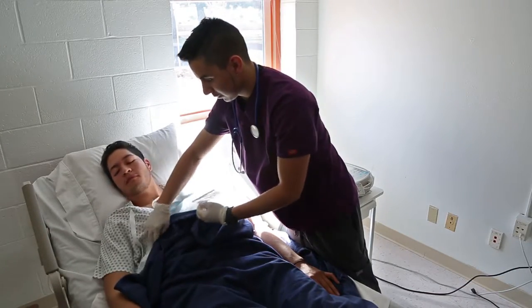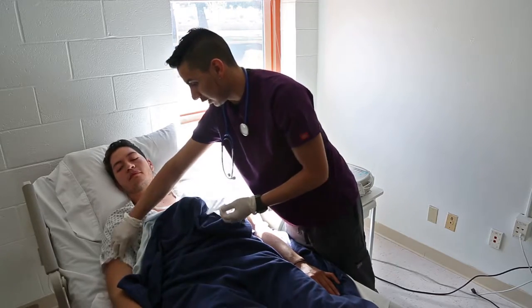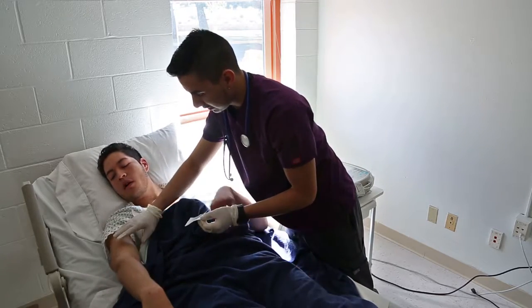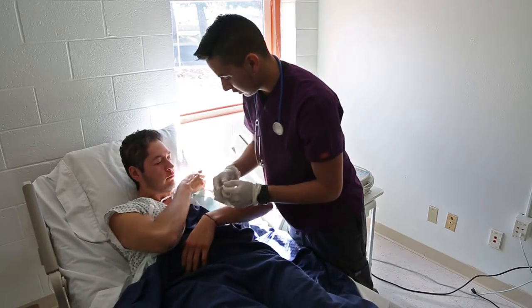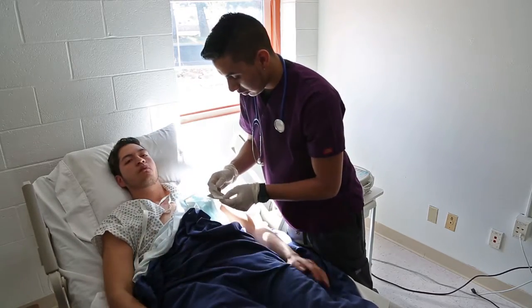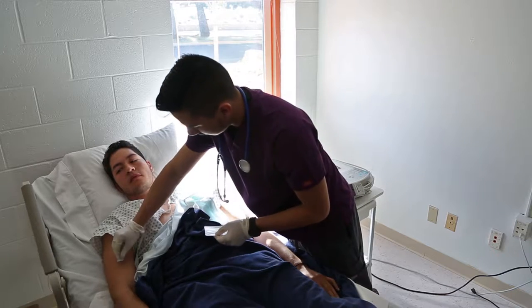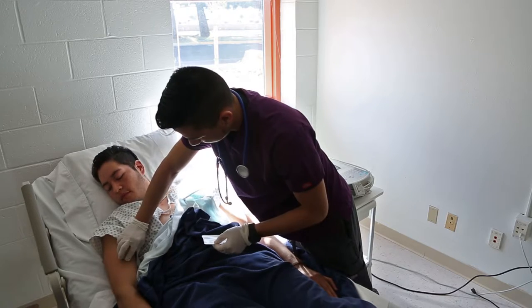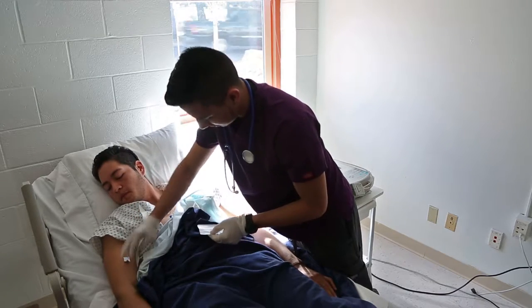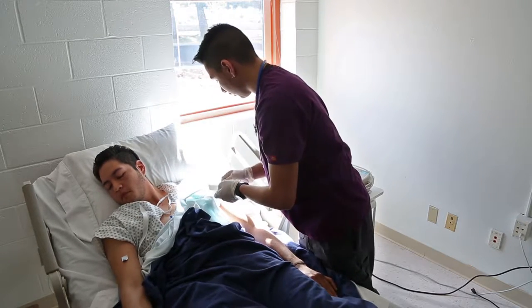I'm going to be rolling up your sleeve. You're going to place the electrode on the same level on both arms. Make sure you don't place it on any burns or bruising. I'm going to be placing this one going down, and this one going down as well.